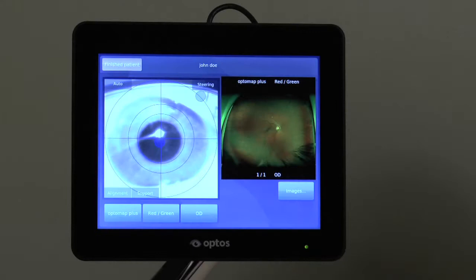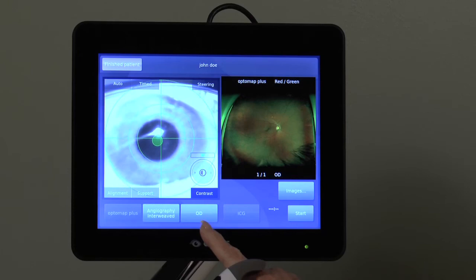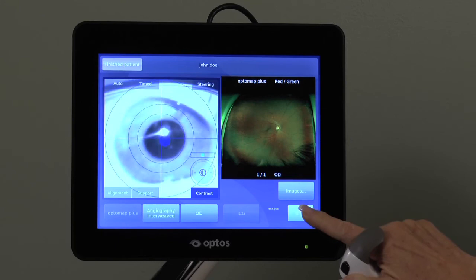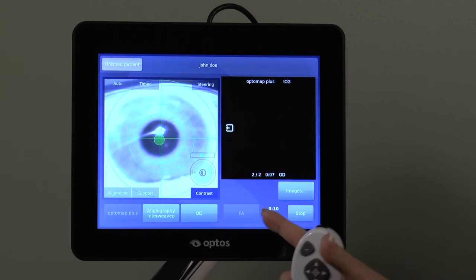When you are performing a simultaneous FA and ICG study, select the Angiography Interweaved procedure, confirm laterality for the study eye, and press either the Start button on the tablet or the Capture button on the hand controller to start the timer. The device will capture an ICG image first, then an FA, and alternate throughout the study.